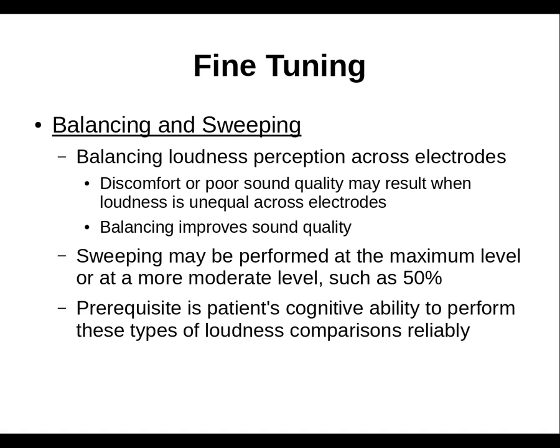across electrodes. This may sound familiar in terms of hearing aids because we talked about it in terms of loudness equalization with hearing aids, where you wanted equal loudness across frequency for the hearing aid user, and that was the basis for NAL. So here we want equal loudness across electrodes. Having equal loudness across electrodes will minimize discomfort and improve sound quality, and maybe even improve speech perception.